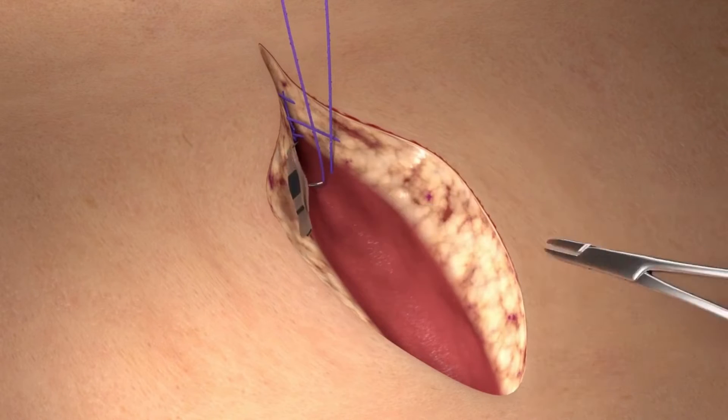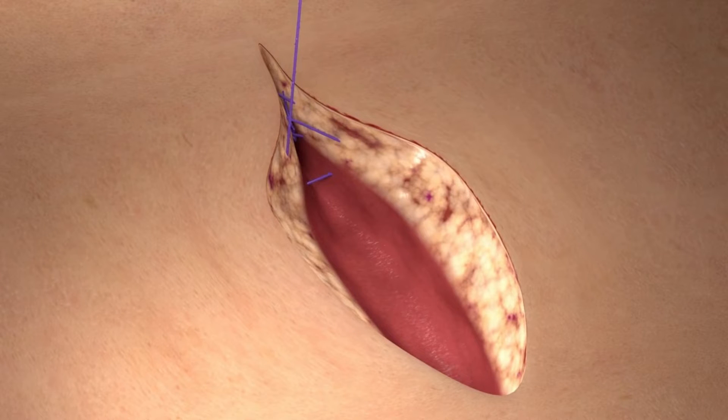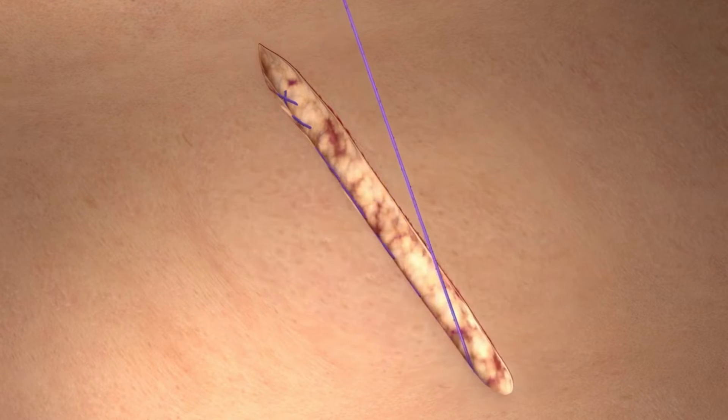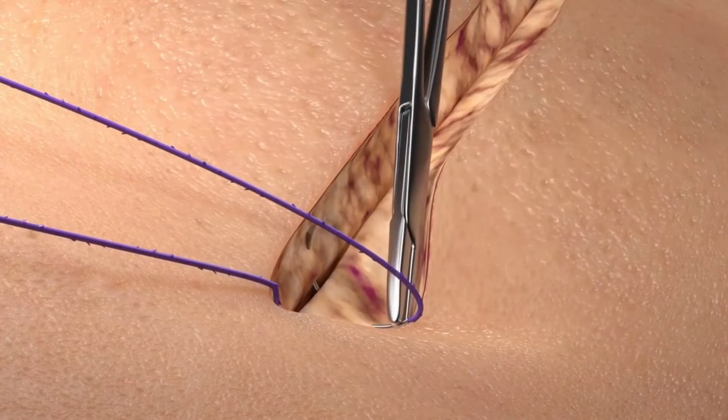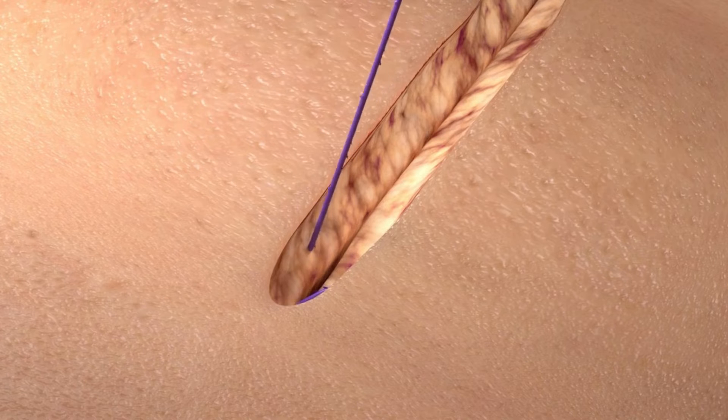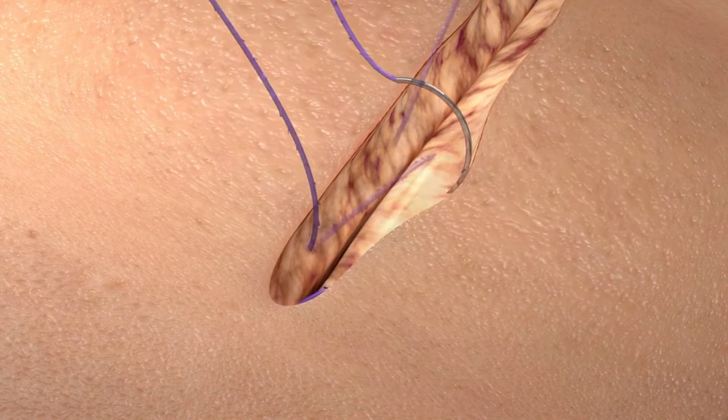We then proceed with the closure of the deep dermis by running the Quill device in a simple continuous fashion. Once the apex has been reached, make the appropriate backstitch back toward the midline of the incision. Once the backstitch is complete, the suture is cut flush with the skin.